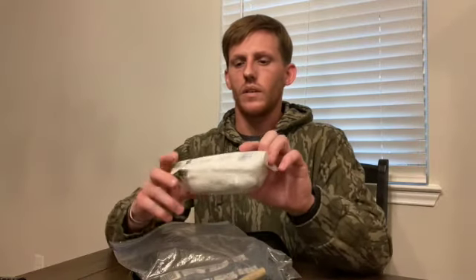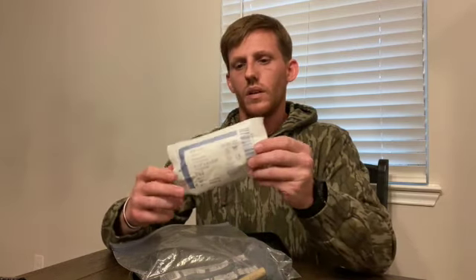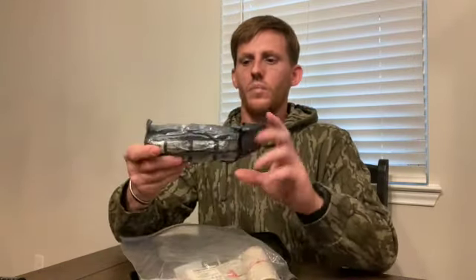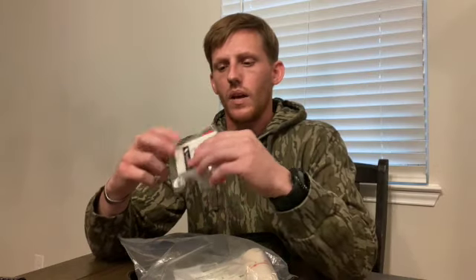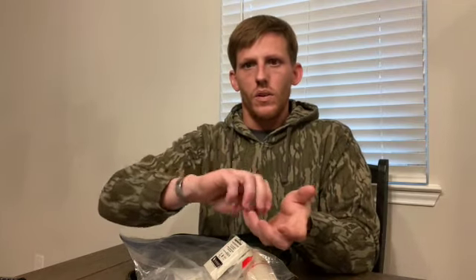Next we got a roll of Curlex, four and a half inch by four yards basically. This is for stuffing a wound and helping to stop bleeding — this stuff comes in handy. We got a six-inch Israeli bandage pressure dressing — same thing as a four inch, just a little bit bigger. We got some compressed gauze from North American Rescue. This stuff is cool because it's compressed really, really tight. It's Z-folded, so it doesn't take up a lot of room at all and it goes a long way. You can hold it in one hand and stuff a wound with the other hand.